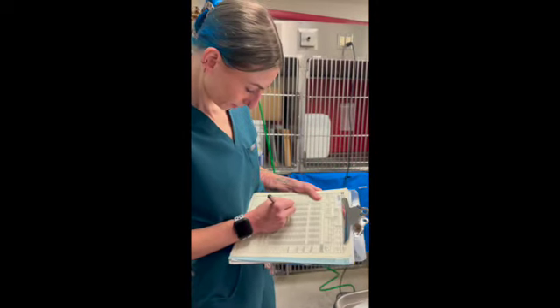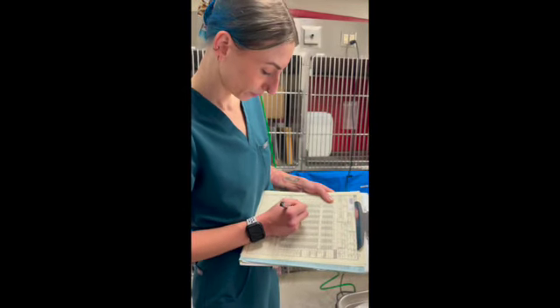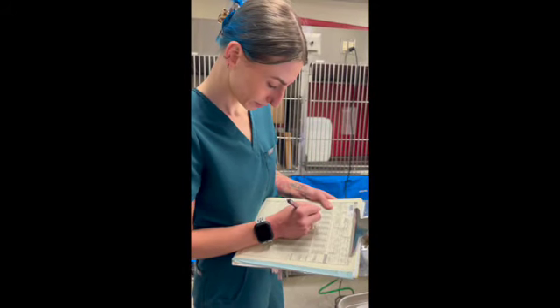And his respiratory rate is around 5, so that's an open circle. We have his end-tidal CO2, which is around 35, so that's going to be an open square. And let's see, his systolic pressure is 134, so that's going to be an up arrow.